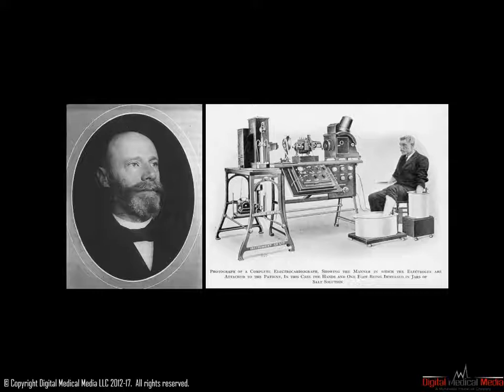surface of the heart. In this image, you see both a picture of Dr. Einthoven and his first practical ECG machine. Unfortunately, this machine weighed approximately 600 pounds and required at least 5 people to operate.